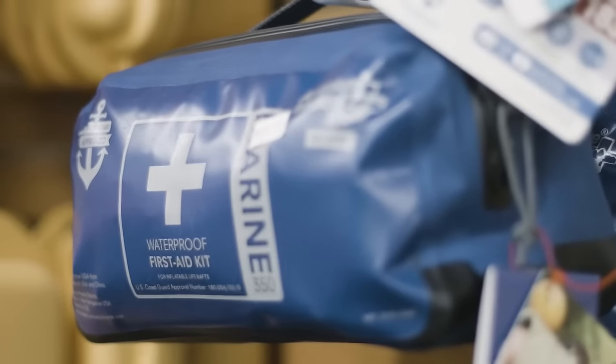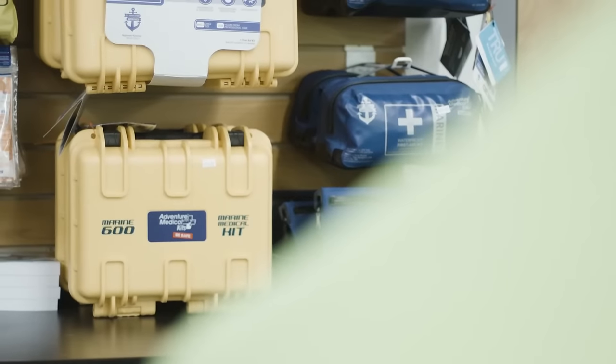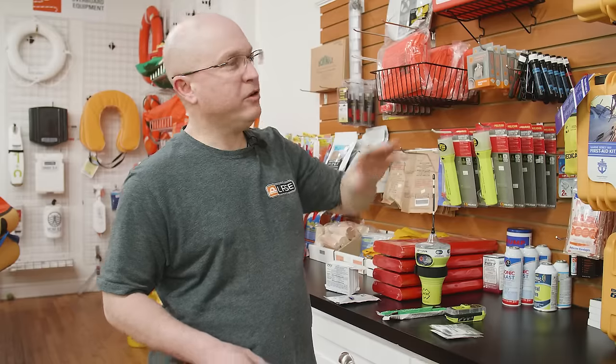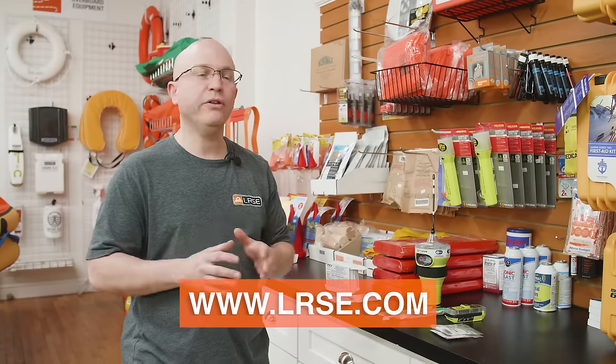We do go up to the 350 kit, and then it jumps up to the 450. We also have the 1500 and the 2500 — it's a very big kit. I couldn't go through all the items; there are just so many. You can find all of these kits on our website at LRSE.com under Adventure Medical Kits. They'll have a list of all the items in each pack.